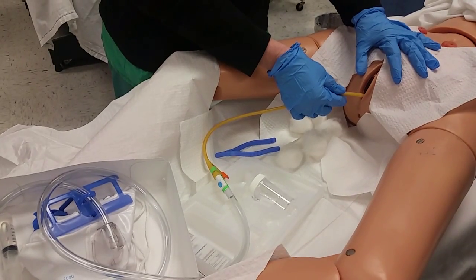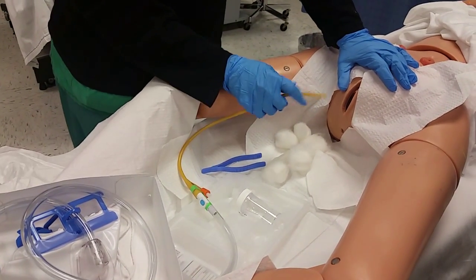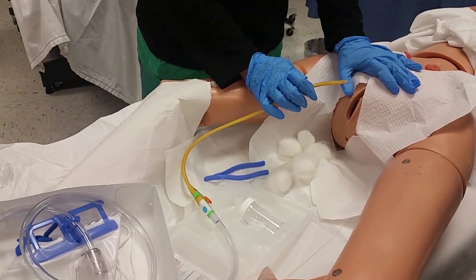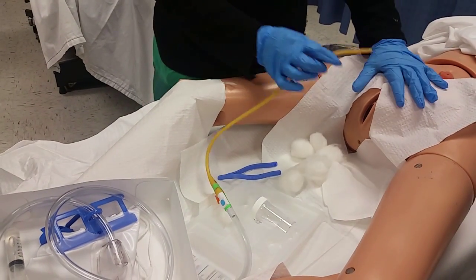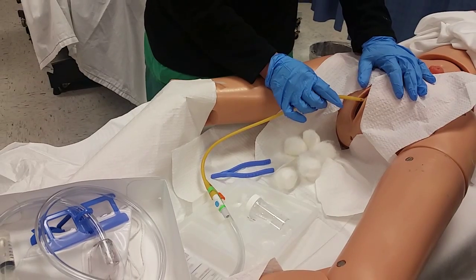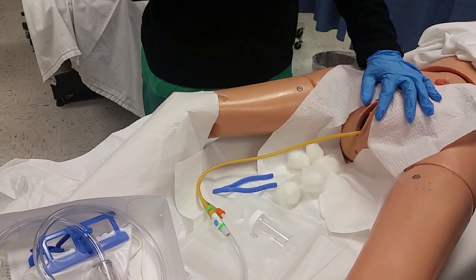Is it common among students to put it in the vagina? I think it depends on the anatomy of the person. When you survey the scene and start wiping, normally the vagina is easily spotted, but on some people their urethra is not where it should be — sometimes it'll be on the wrong side. The folds and everything else — there are times where I know that's not the vagina because I can see the vagina, so it must be the urethra, and it won't be. You would just leave it right there, keep your hands sterile, and know you've got to go somewhere else.